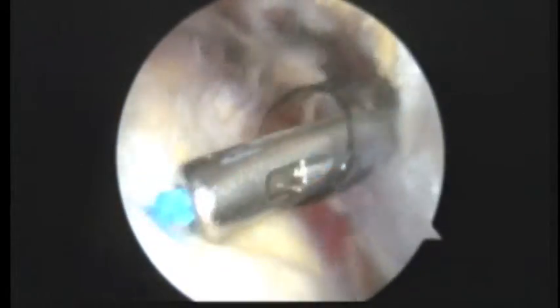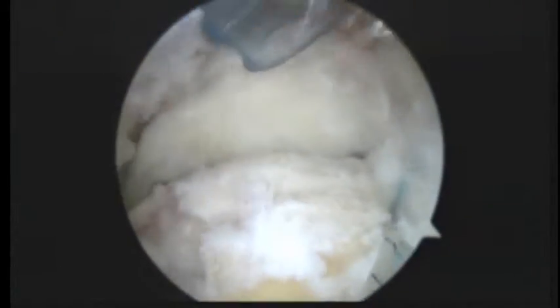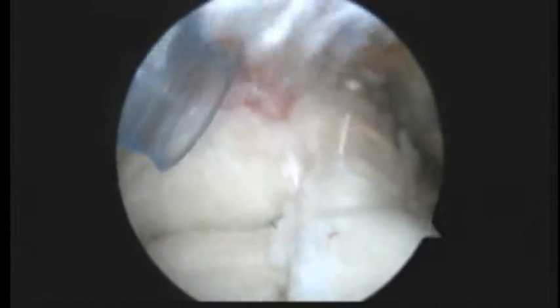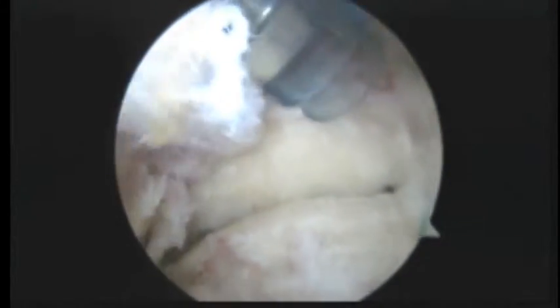So we're going to clip the suture tails and show you where we're at. Here's the rest of the tear right here. We've still got some more sutures coming from the anchor. We're going to use those next to tighten down the rest of this tendon. We'll show you some more in a minute.